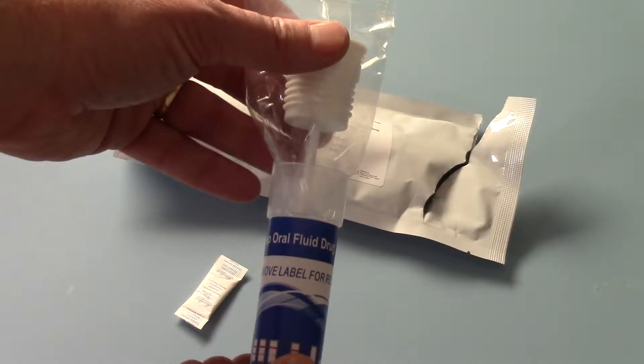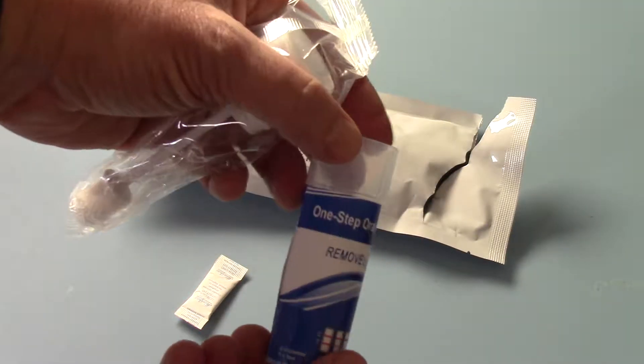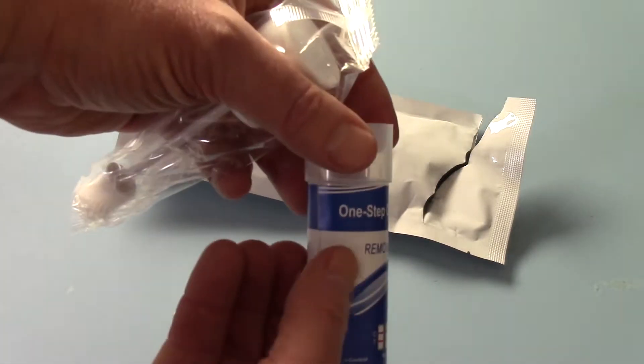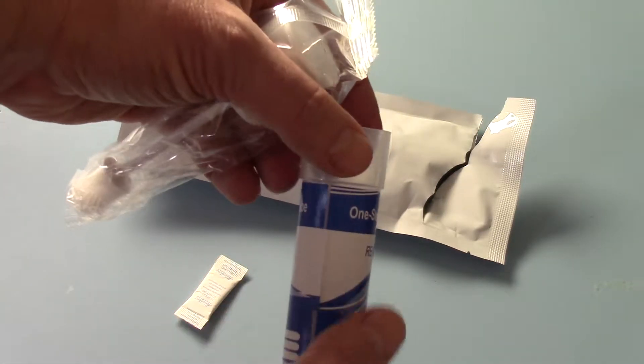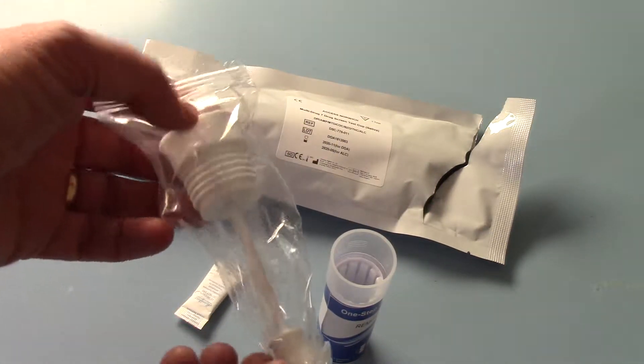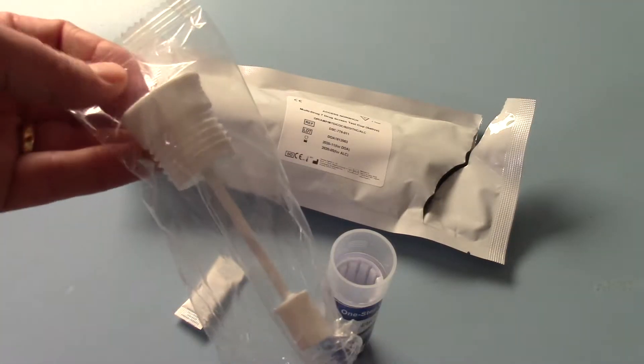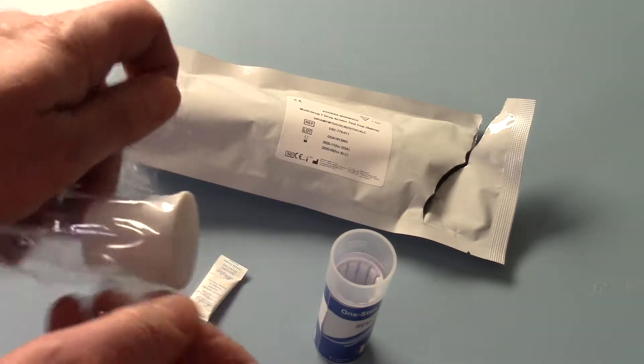And then you've got the two elements of the test. This is the barrel test with the drug test loaded around the outside. You'll see the middle section of this says 'remove label' — that is where you read your results. And then you have a cellophane saliva collector swab, which has to be open to use.